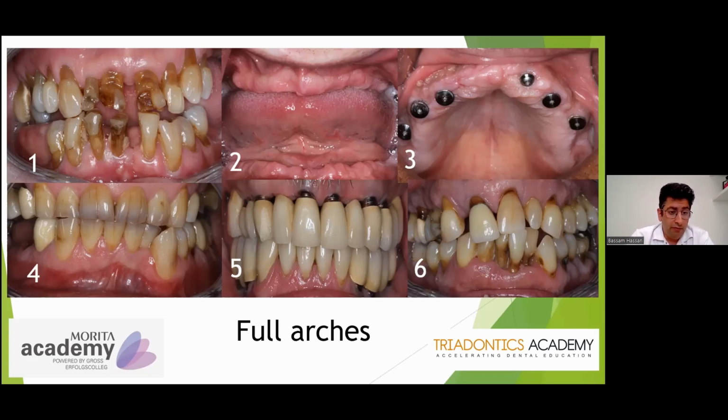Case number four looks very simple. You have a fixed bite situation. You also have teeth, lots of references, but you have malocclusion. So at the time, any digital workflow would require first an orthodontic treatment, and some orthodontic treatments for cases like these were not really digital, because you would go with the brackets. So it did not really work with digital in the beginning.